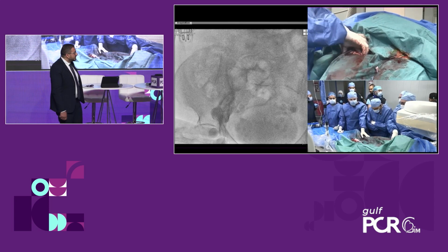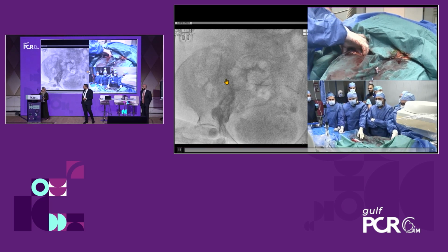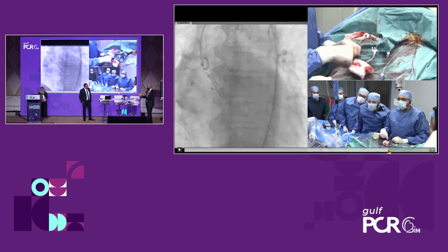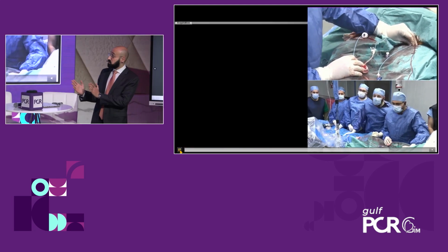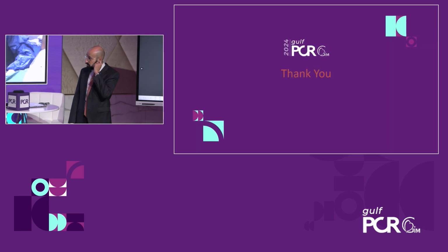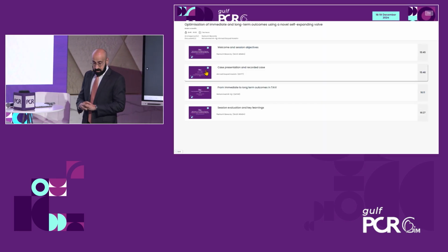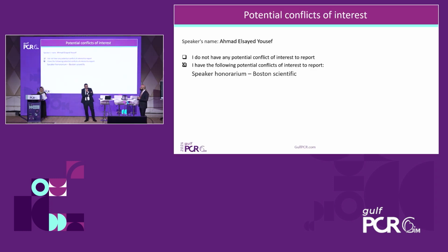Wonderful case. I just want to go back to one thing that, if possible, I would like to highlight, because we're going to go back to it in a second. You've shown in two orthogonal views that the valve is well expanded. Yes, I think it's very important, and I think we'll touch base on that in the discussion. I think Rasha, you want to mention something? So the whole idea is that you can see the posts and they're aligned in a parallel way. So that gives you an idea that it's actually well expanded.